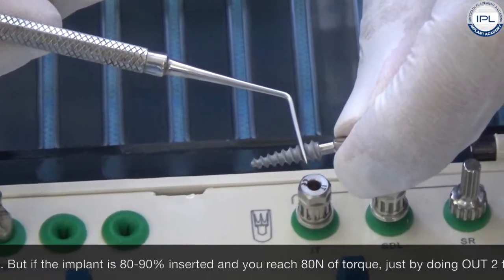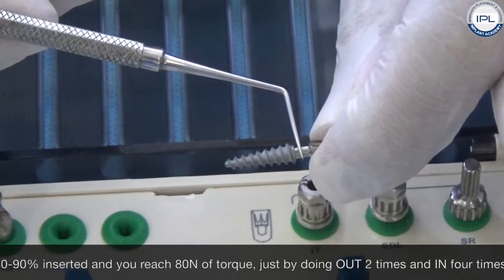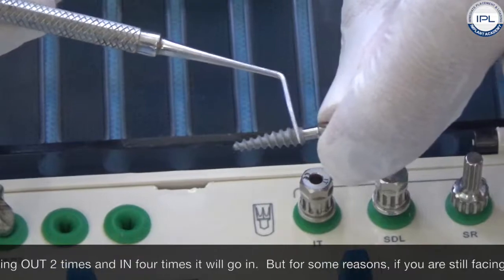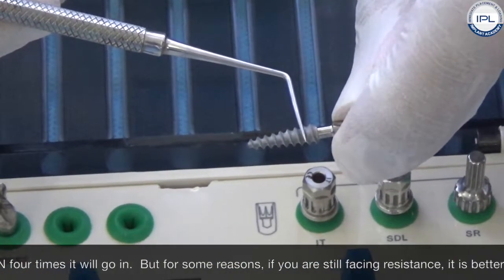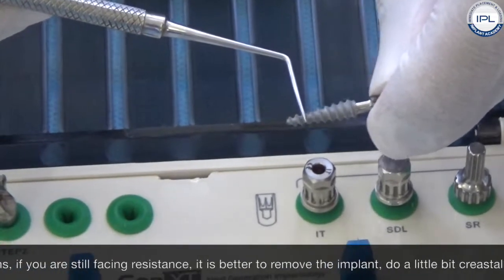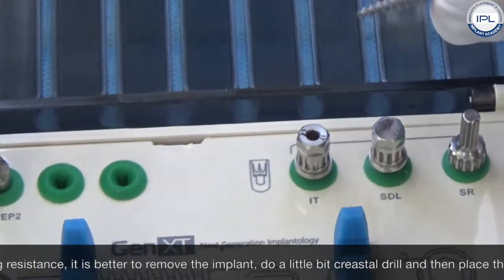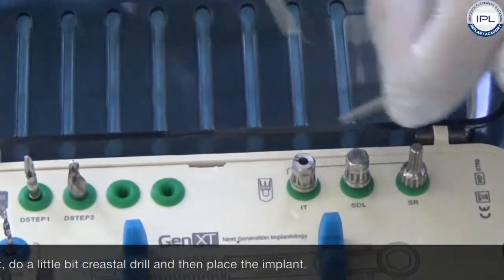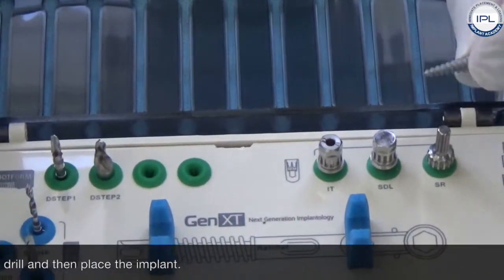By doing out two turns and in four times, it will go in. But if you are still facing resistance — meaning it is going out two and in only two times — it is better to remove the implant, do a little crestal drilling, and then place the implant in. We don't want to fight with the implant and we don't want to fight with the bone.